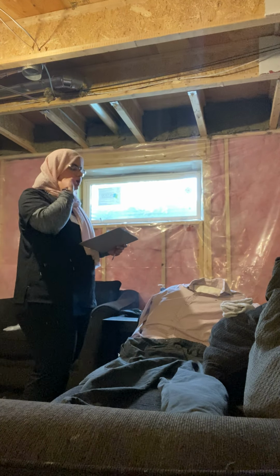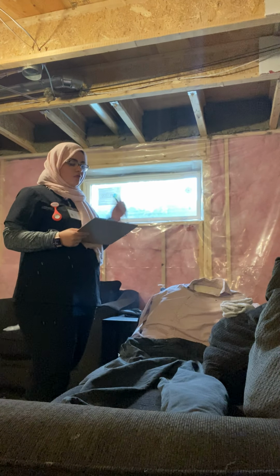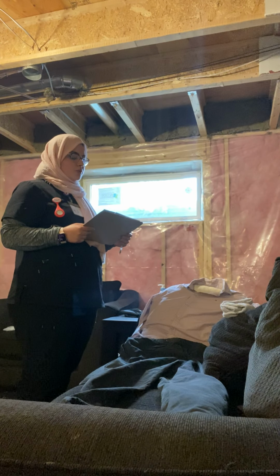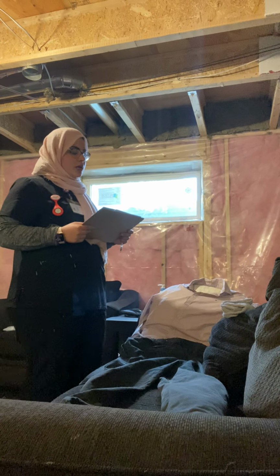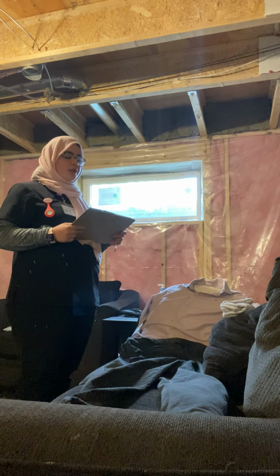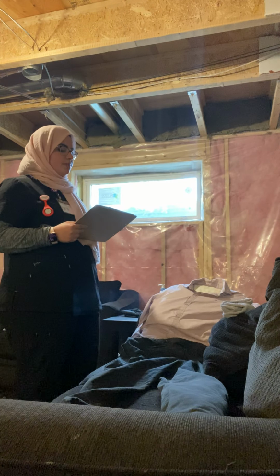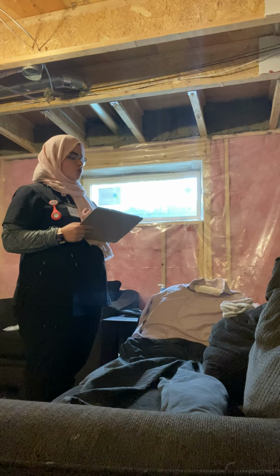Tom, if that's okay with you. So I have taken vital signs. Blood pressure is 125/88, lying down. Respirations are a little bit better, 16 breaths per minute, non-labored and deep, SpO2 98% on room air, within normal range. Heart rate is a little bit lower and still within the normal ranges, 80 beats per minute, regular and strong. Temperature 37.1, which is good.